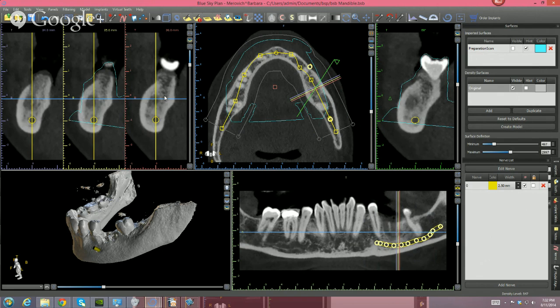So the question is, well, if I can't do an implant case with guided surgery within a quarter of a millimeter of the nerve or a vital structure, what's the point of doing guided surgery? Well, the reason is to put the implant exactly where you had planned it, much better than your eyeball could do. You can find out all the problems like submandibular fossas and so on easier. Your placement can be dead on, which reduces the need for custom abutments.